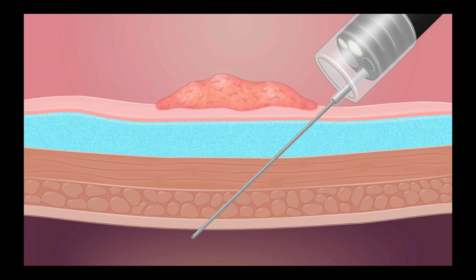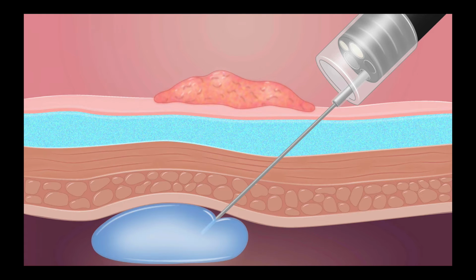The needle will go through and through, and as the assistant injects, he may push 5 to 10 cc's without your knowledge. This is one thing you should avoid.